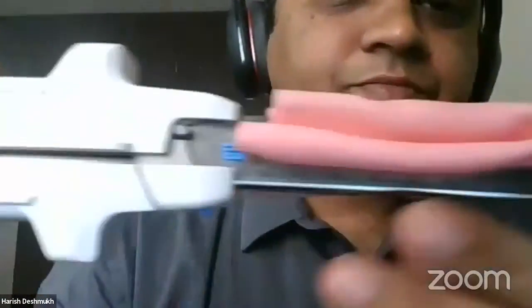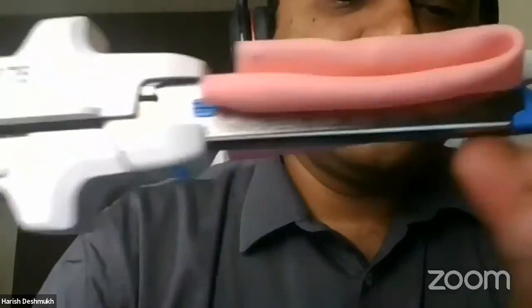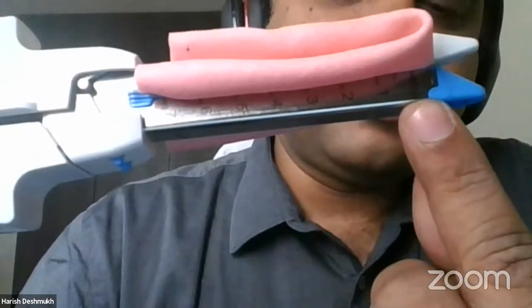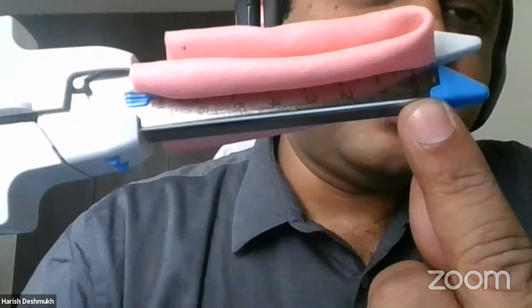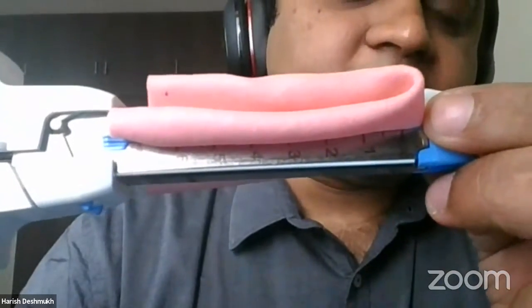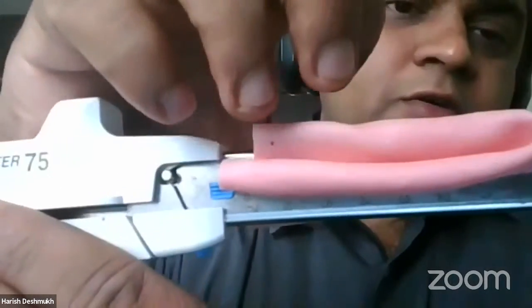Now here, what I have done is I just folded the tissue so that I can accommodate it in the gun. If you see here, the tissue is well within the gun, right, sir? It is well within the staple line. But what will happen is the tissue creeps out a bit. When you are firing, the tissue doesn't hold at the same level.